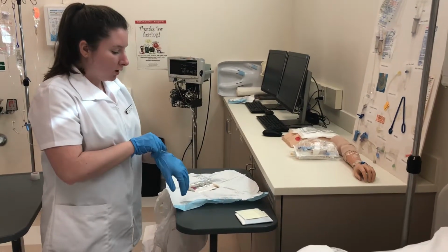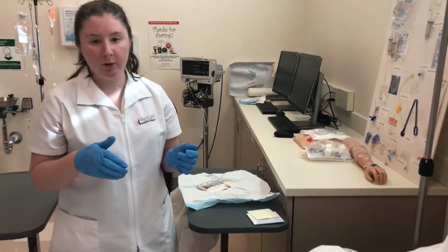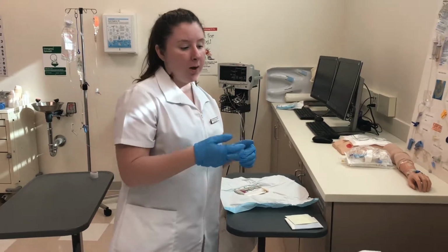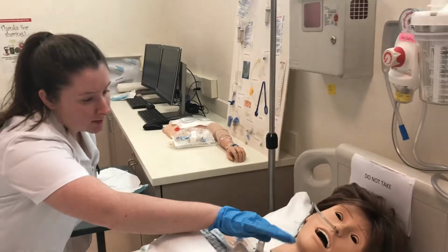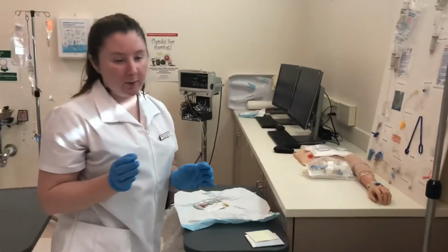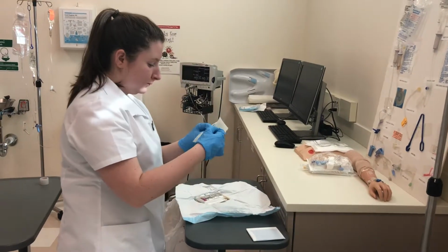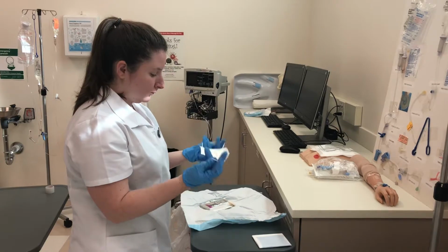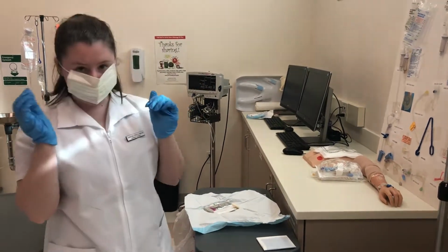So my gloves are on, and what I would also be doing is, if this kit came with 2 masks, I would be putting 1 on the patient and 1 on myself, but because this kit only comes with 1, I'm going to instruct the patient to keep their head facing away, and her head is already facing away, so we're set with that. So I'm going to put this mask on myself. Wrap it around my ears. Alright, so this is wrapped around my ears.